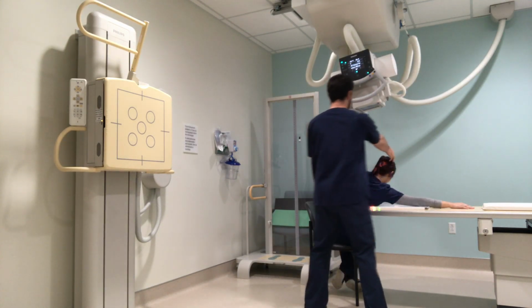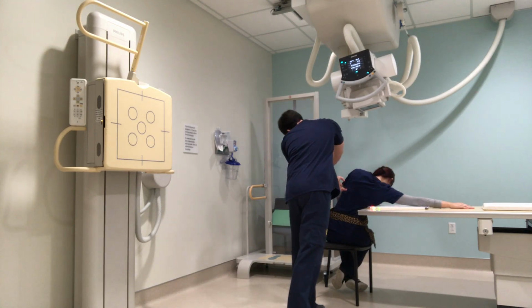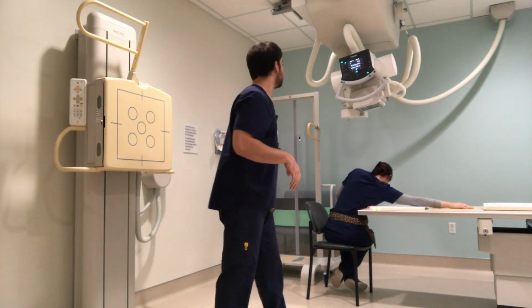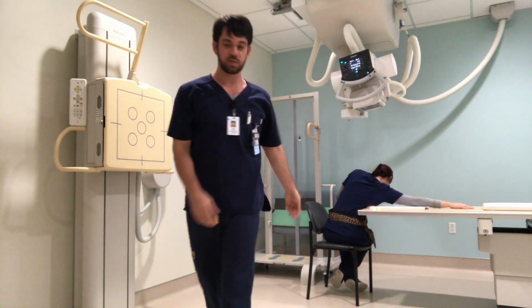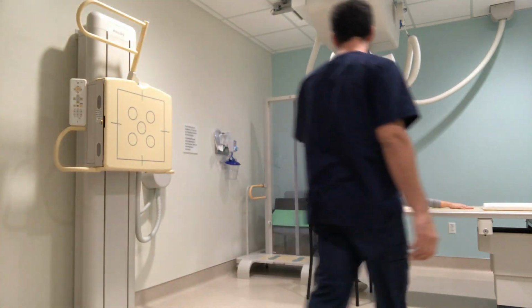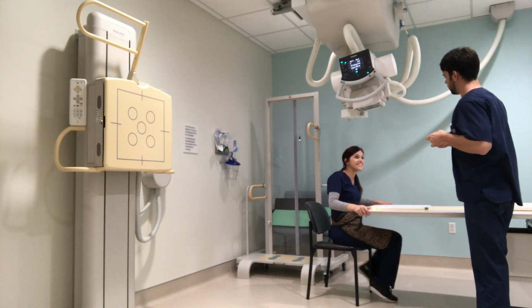Now for this projection, we're going to want you to have your head sort of down and then a little bit to the left to make sure we don't get it in the image. It's going to be incredibly uncomfortable for most patients to do that, so we'll try and make this quick. All right, X-ray. All right, ma'am, you're all done. We'll have those images sent over as soon as possible. Thank you. You're welcome.